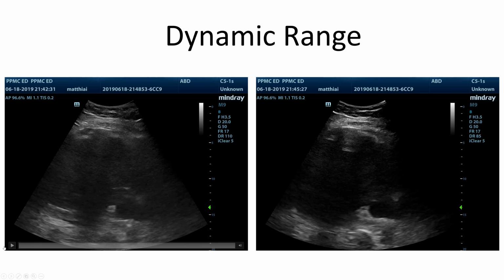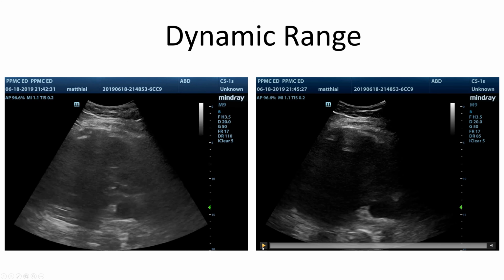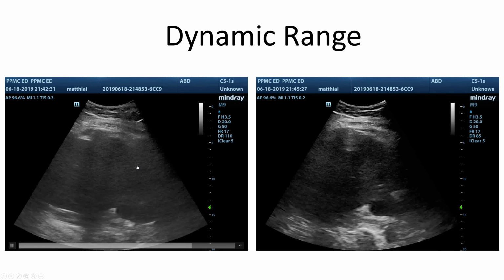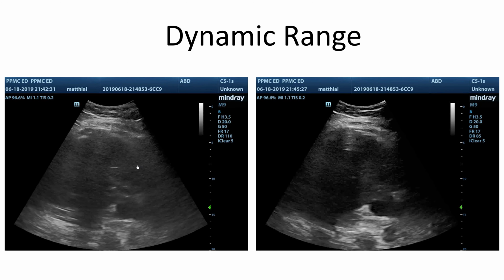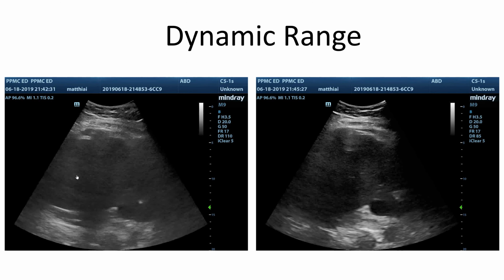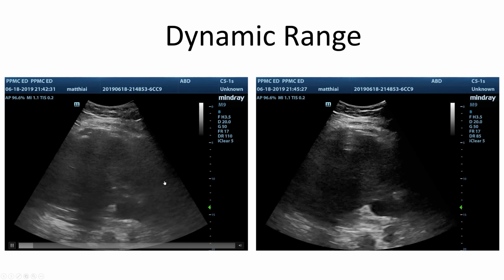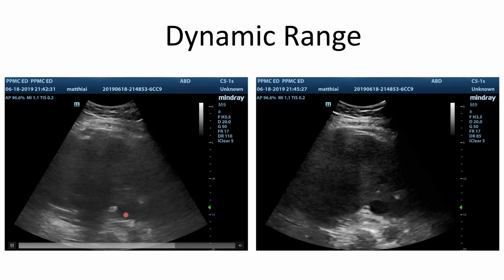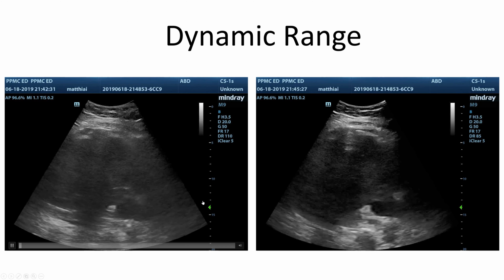The answer that I use in my practice pretty often is that it is another trick that can help us identify vessels and fluid-filled things. So here is the image on screen left, and I want to see this IVC, and I want to make a choice about whether or not to diurese this person.